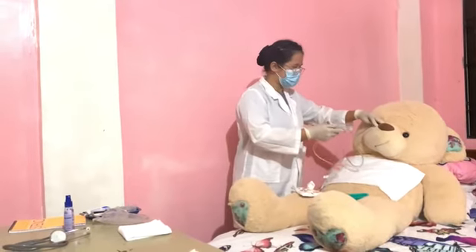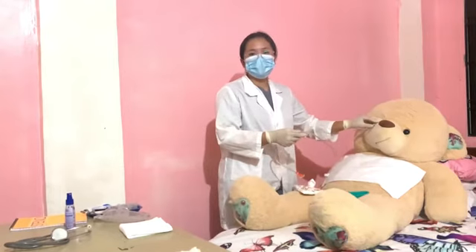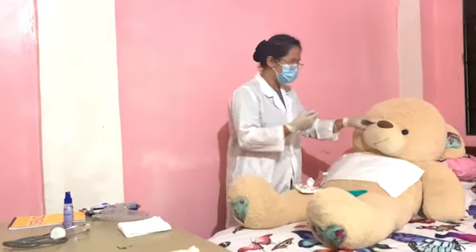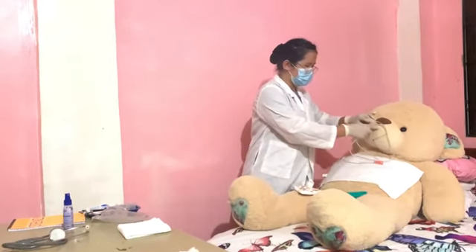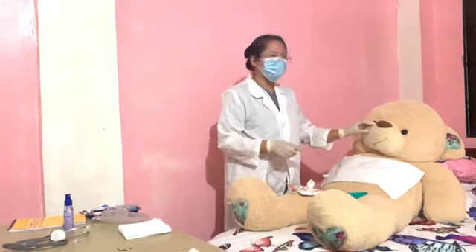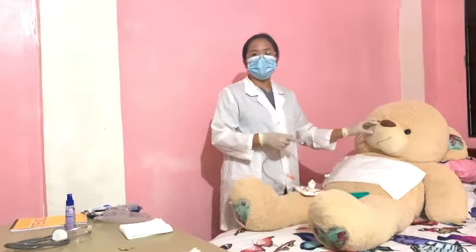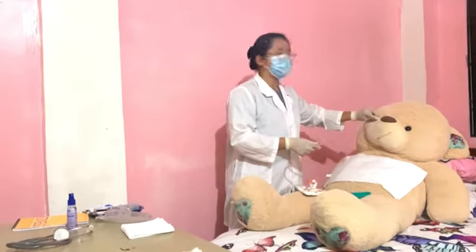Ma'am, meron po tayong tissue pag naiiyak po kayo. You can use that. And then when the pharynx is reached, instruct the patient to touch the chin to the chest. So ma'am, pwede po ba kayong yumuko kung maabot niyo po yung chest niyo? Okay, thank you po. Encourage the patient to swallow even if no fluids are permitted. So ma'am, kahit po walang fluids akong ibigay sa inyo, pwede po bang mag-swallow po kayo? Sige po. 1, 2, 3, swallow ma'am. Swallow po. Okay po. Thank you.